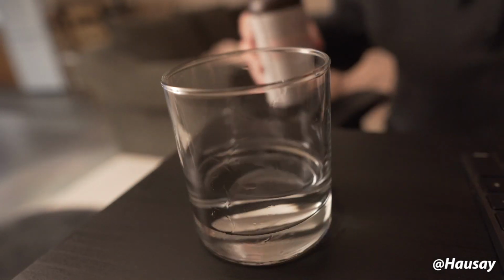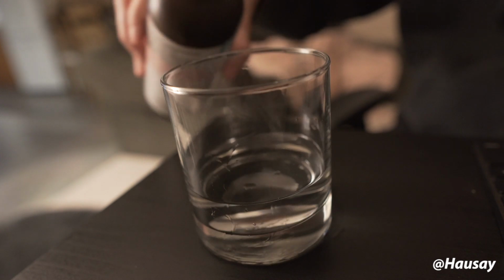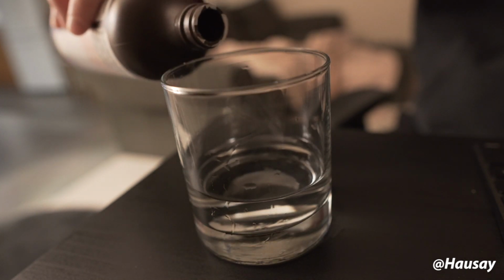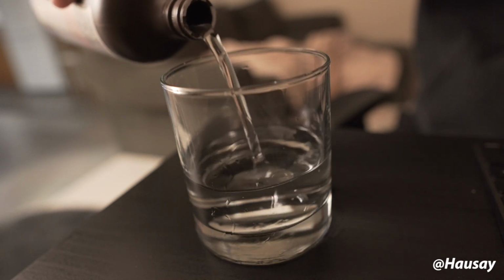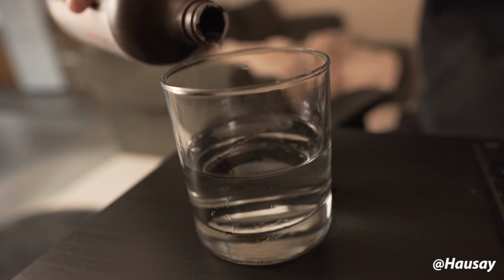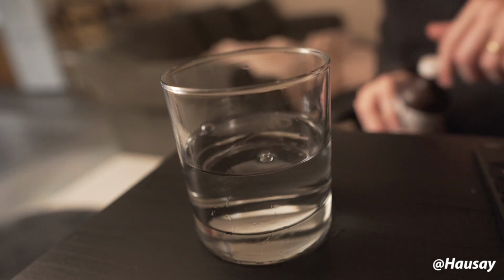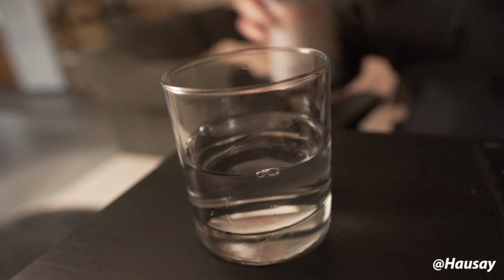So then you're gonna have this much warm water, and then you're gonna wanna do a 1-to-1 ratio. So you're gonna put the same amount of hydrogen peroxide in there, approximately. There we go. So now this is half hydrogen peroxide and half warm water, and that is literally all you need, other than a retainer.